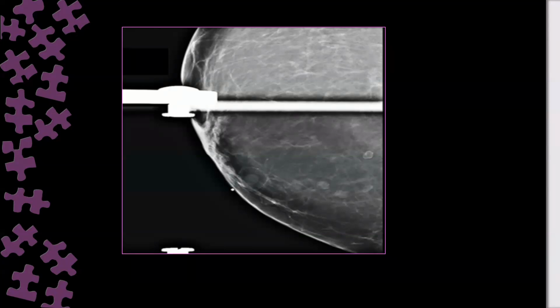Deep or superficial? Superficial. Can you comment? Can you see what this structure is? Is the skin here? Can you see skin here and skin here? Here it is sharper. And what is this? Nipple marker. Yeah, this is a skin marker. This is a BB marker.